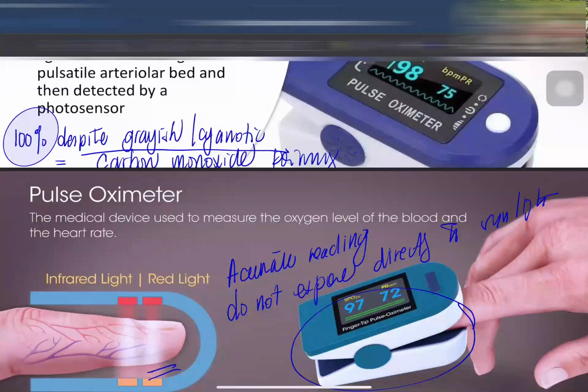Now, sa usual na pasyente natin, halimbawa, if you are assessing a patient with cough, pagkatapos nakikita mo yung patient ineffective airway clearance, expected bababa yung O2 sat. Pag nakita kong isang patient cyanotic, I'd expect that the O2 sat is also low. But if you will encounter a patient na grayish siya, or cyanotic siya, pagkatapos yung O2 sat reading niya class is 100%, one thing that you need to look into is that your patient may have carbon monoxide poisoning.